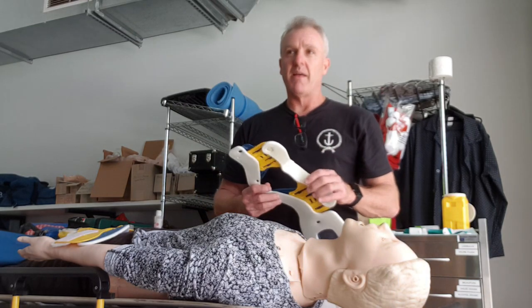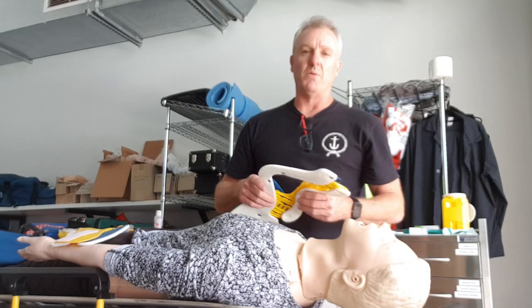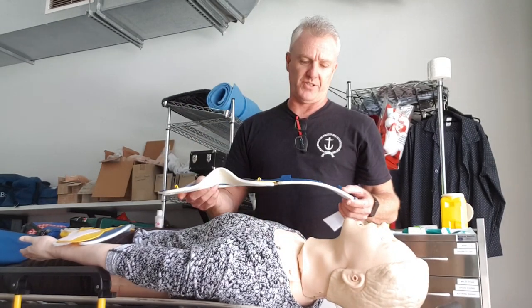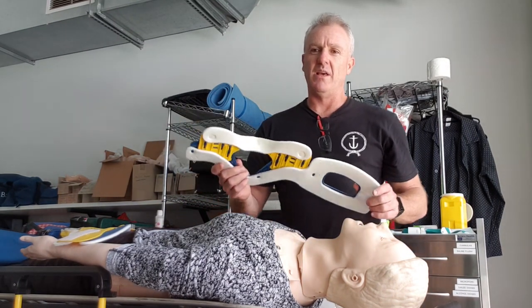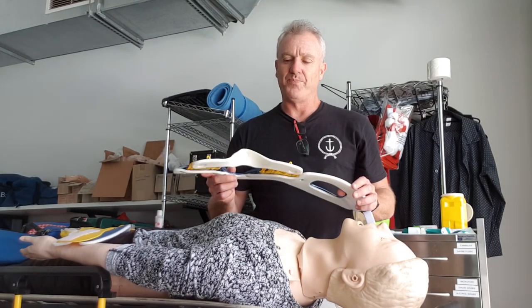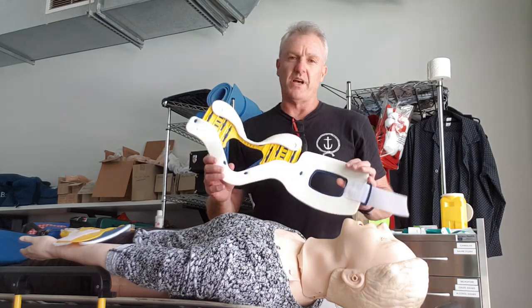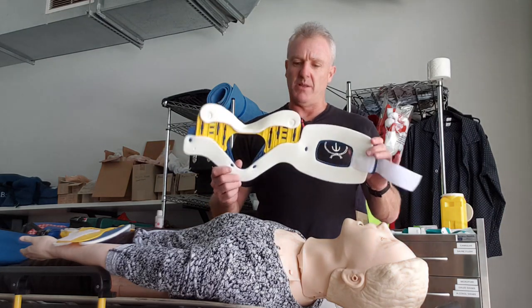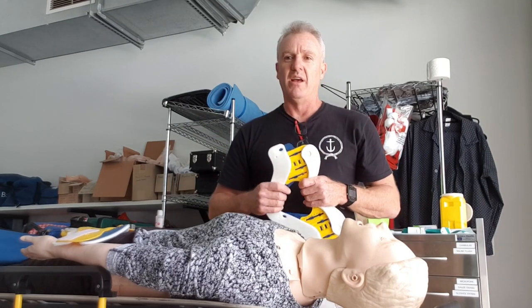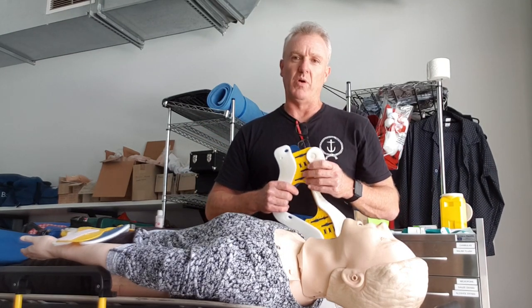Hi guys. I thought after yesterday's pracs that I might take this time to do just a short instructional video for your i2 sites. There seemed to be a little bit of confusion about how to apply a C collar, and also the way I demonstrated in the pracs seemed to be something new to a lot of you, so I thought it's probably worth covering it in just a quick video for week one.